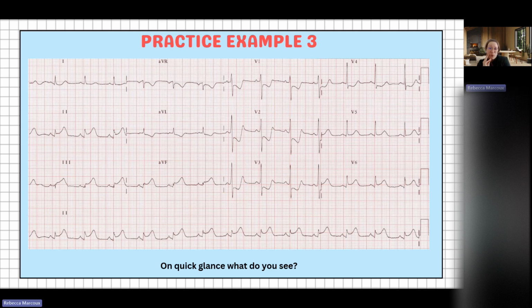Yeah, I would say both are warranted. At minimum, posterior leads, but I think both would be very reasonable in this patient.